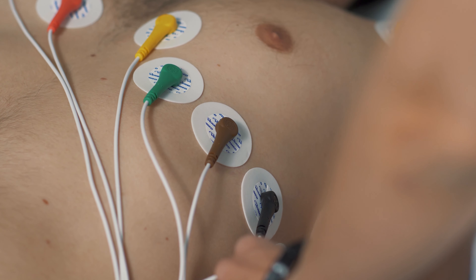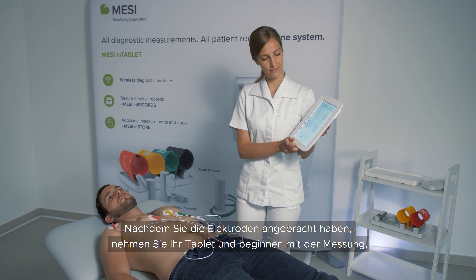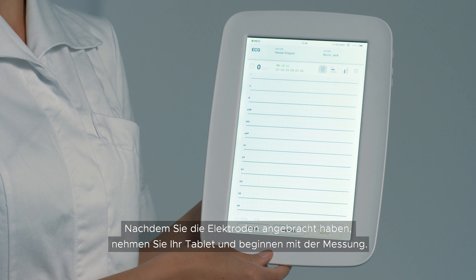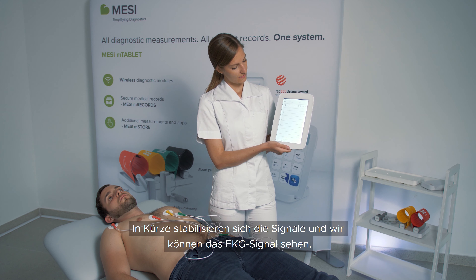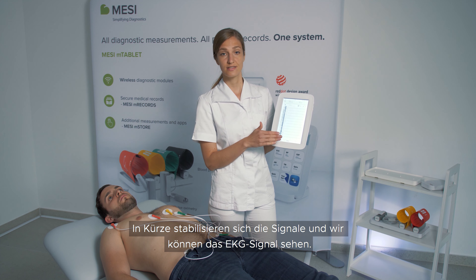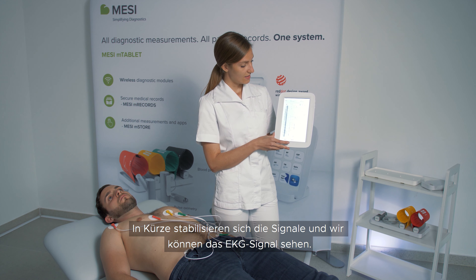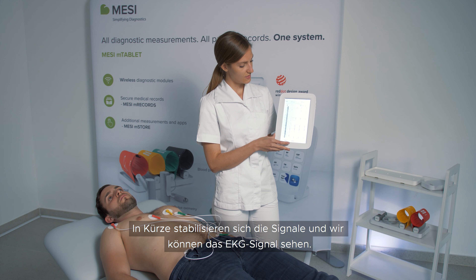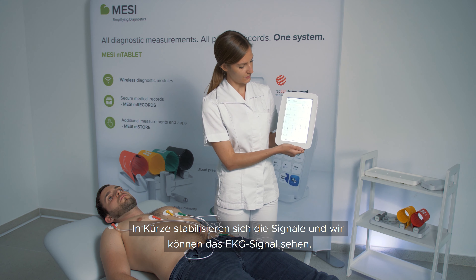After you have placed the electrodes, you will take your M-Tablet and you will start the measurement. Very shortly, the signals will stabilize and we will be able to see the ECG signal.